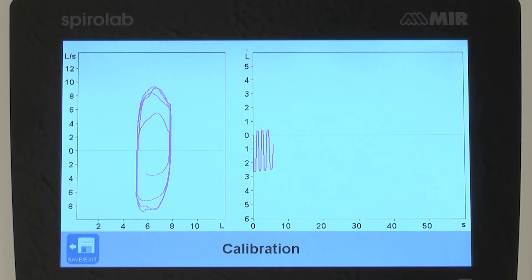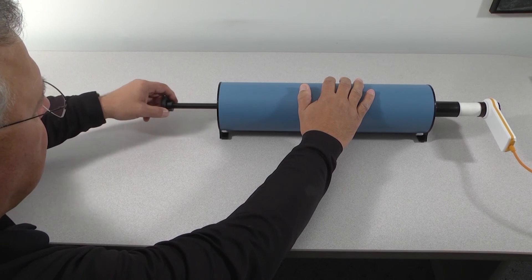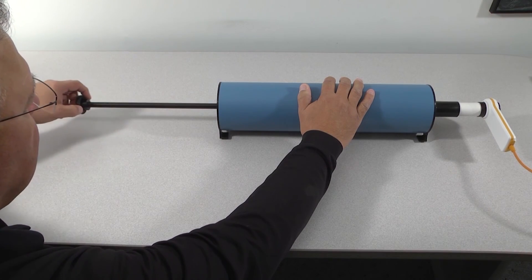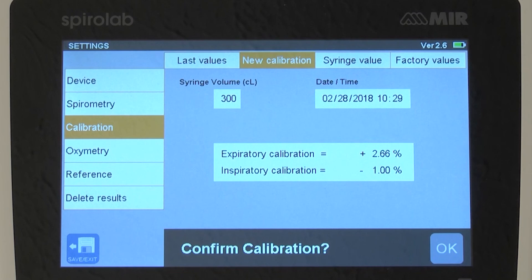If the results are still outside of the 3% range again, redo the test for a third time, checking to be sure you have a tight seal and that no air is leaking at the syringe and the turbine. Be sure to pull and push the syringe piston all the way to the built-in stops in each direction. If you do not get a passing range of plus or minus 3%, contact MIR customer support. Initially you may experience results that are out of range, but as you repeat the procedure, you will become more consistent with the speeds at which you are pushing the plunger, and your results will become more accurate.